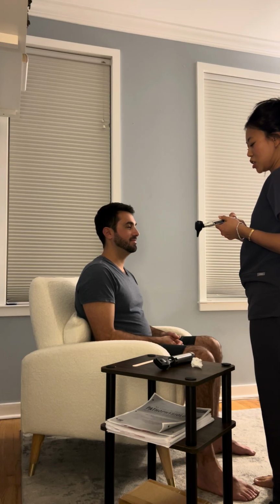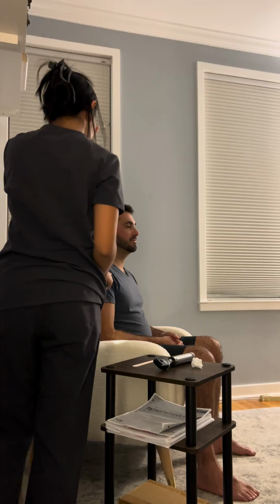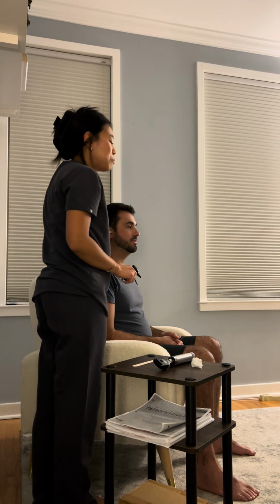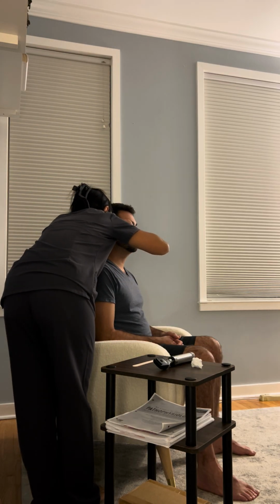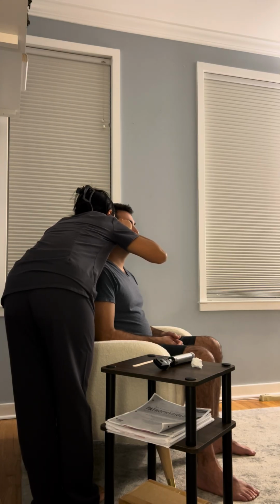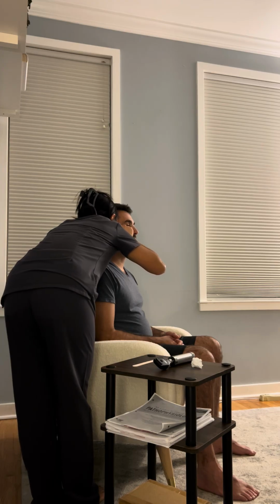Okay. Now I'm going to just look inside your ear to check for any inflammation. Okay, we're going to pull the pinna back, out. Okay, looks good.